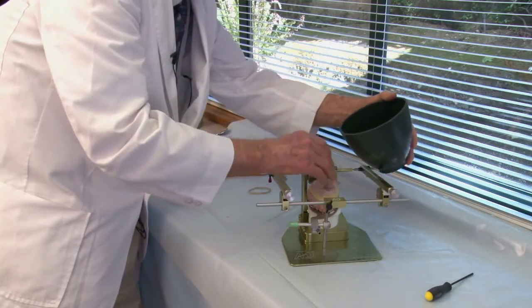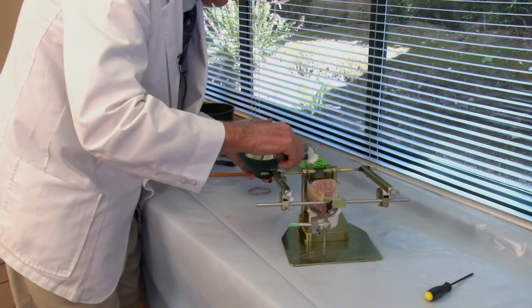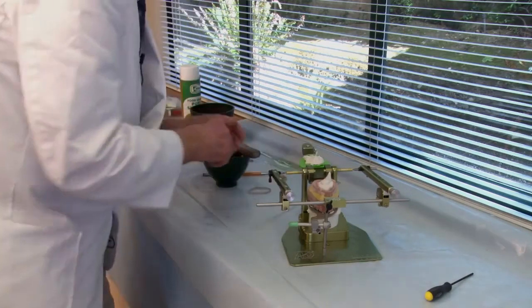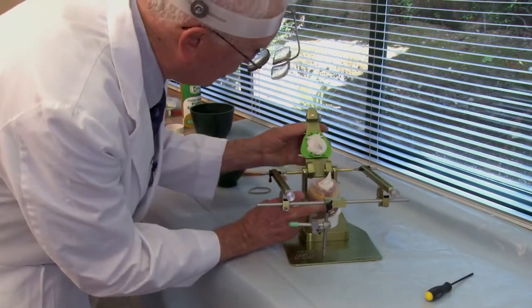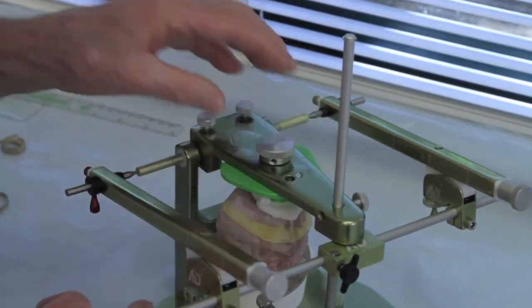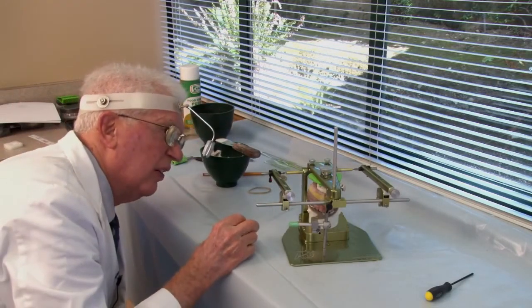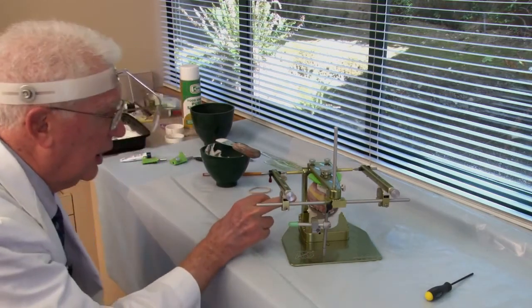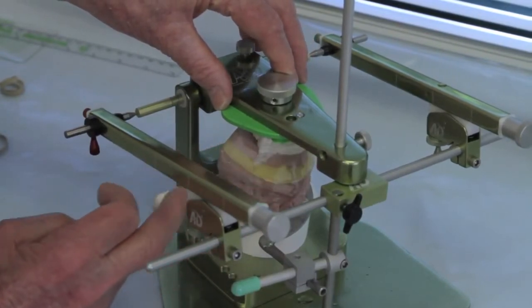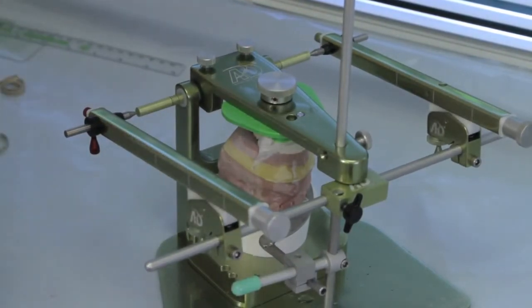So I'm going to get a little water and put on the model first and make sure I vibrate it into the undercuts so I have good retention. And there may be some tendency for it to be pushed forward. So once I know that I've got enough mounting stone holding the model in place, I don't try to add more. I'll make it pretty later. I'll fill in all the area and make it pretty later. So now we just have to wait on that to harden.